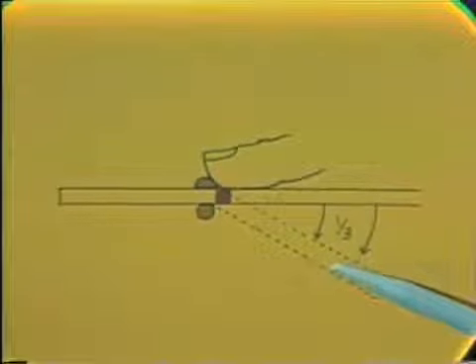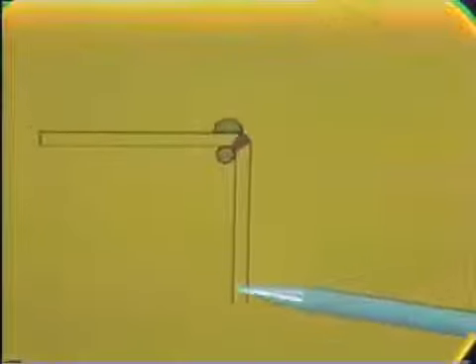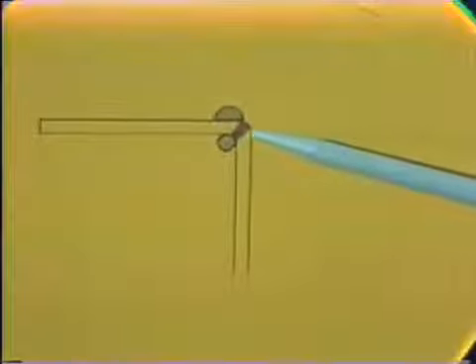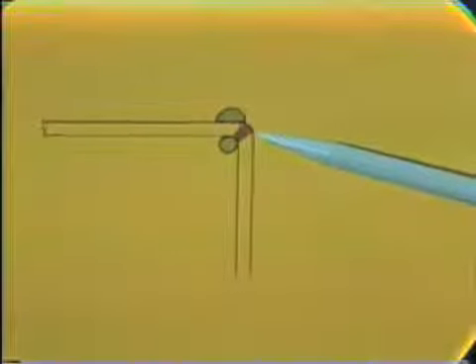At this point, the wire is checked on the pattern or the work model to determine if it's being made in the right spot, and if it's correct, the bend is completed in this manner, and the completed bend will have the mark that you made in the wire directly at the corner of the pattern.